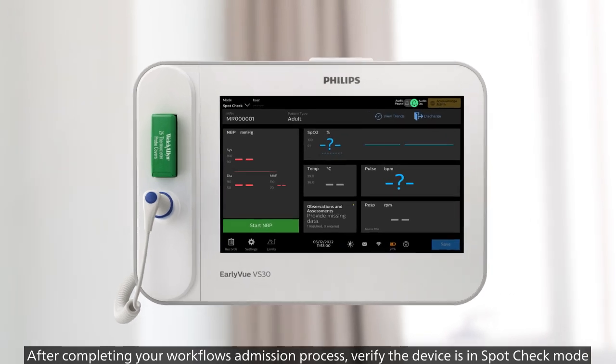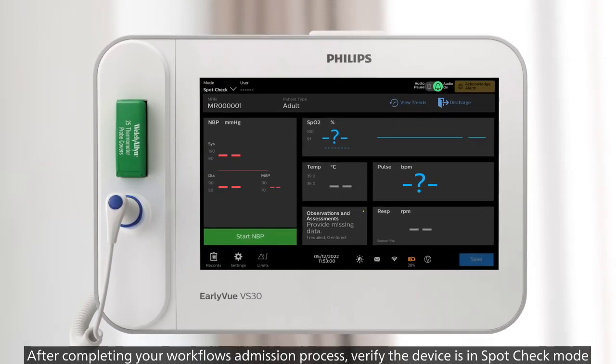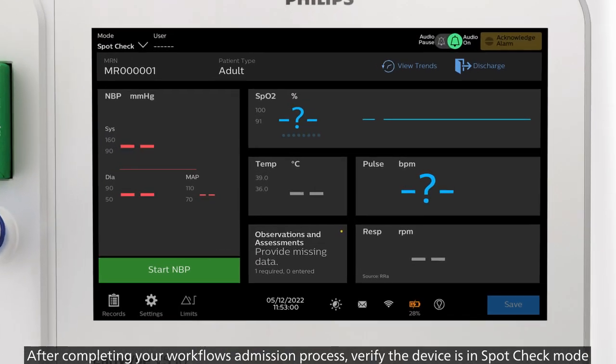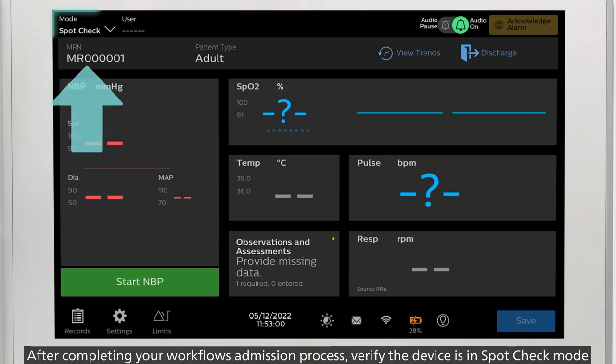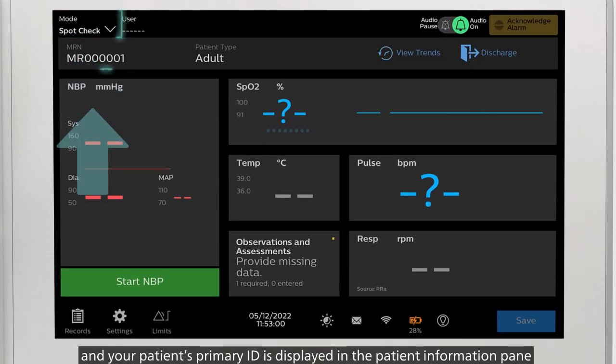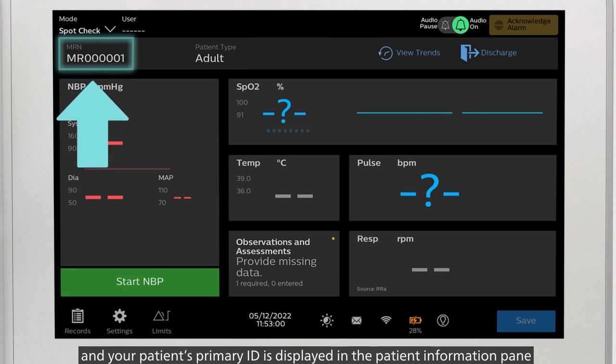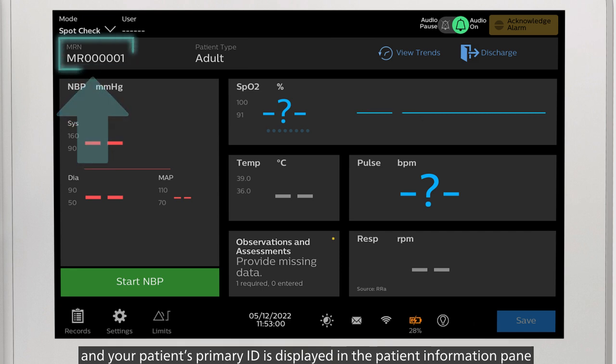After completing your workflow's admission process, verify the device is in spot check mode and your patient's primary ID is displayed in the patient information pane.